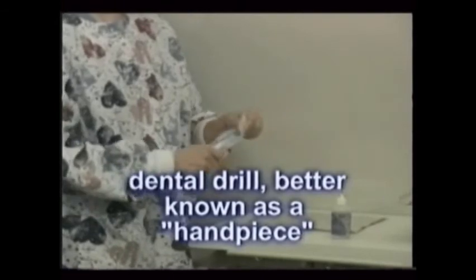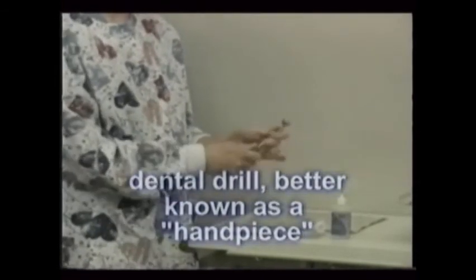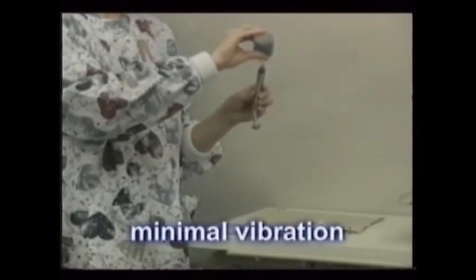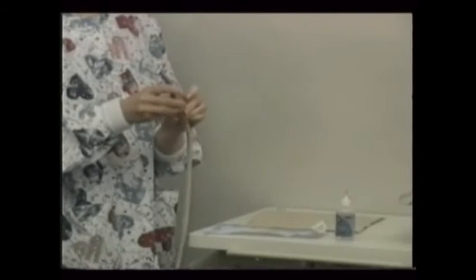The high-speed dental drill, which is known in dentistry as a handpiece, has reduced the time needed for removing decay and reshaping a tooth from many minutes to just seconds in some instances. Vibration is minimal and patient comfort is enhanced. Notice that the assistant is remembering to use a clean lubricant different from the one used in the sterilization process before it was sterilized.